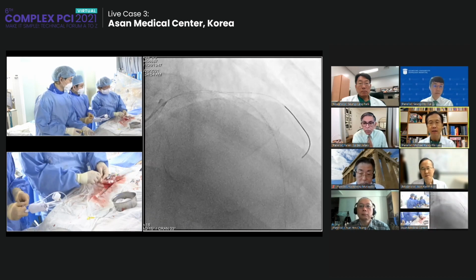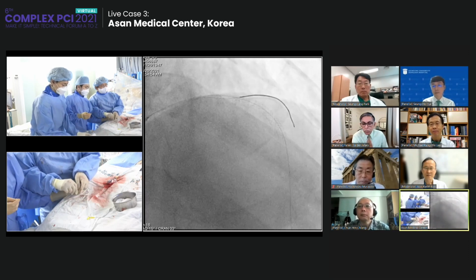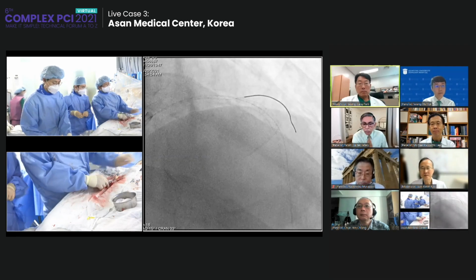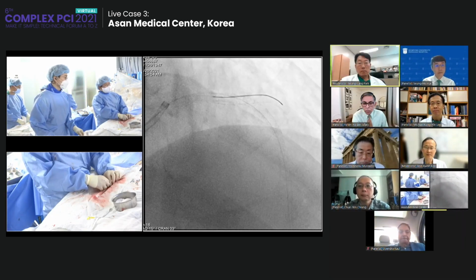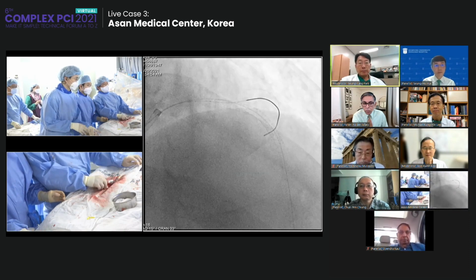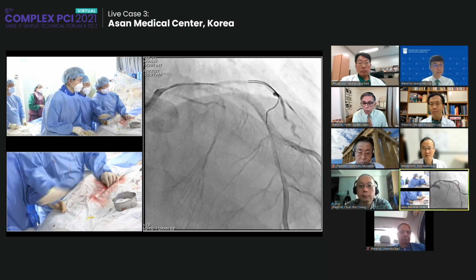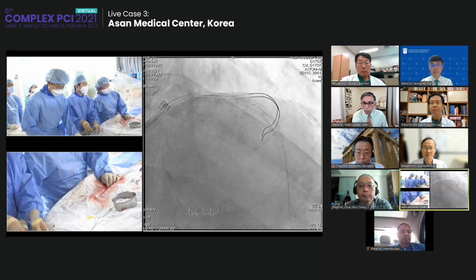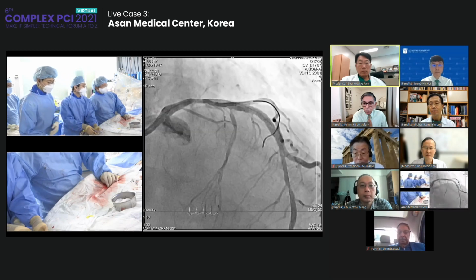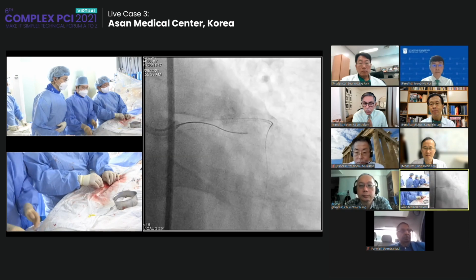What's the ACT now? You want to check the ACT as well? Yes, okay, I will check the ACT. Ready? Wire, keep the wire down, okay. Please. Ready? Ready. Okay. Great. Getting better. Test.